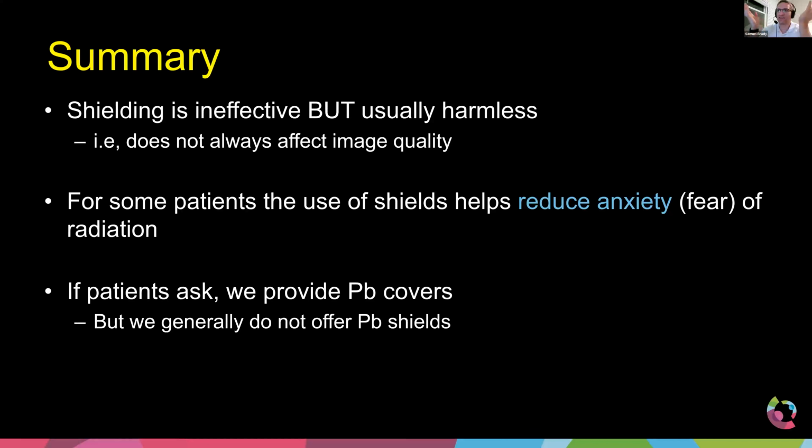Well, the answer is no, it's not really necessary, but where you work, yes, you have to because it's a law. I don't know what the laws are in Thailand, for example, where you may not have a physical law that says anyone in an x-ray room has to wear shielding. If that law does not exist, then that's something that I would encourage the radiologists, the medical physicists, and your technologists to talk about. Is it necessary?